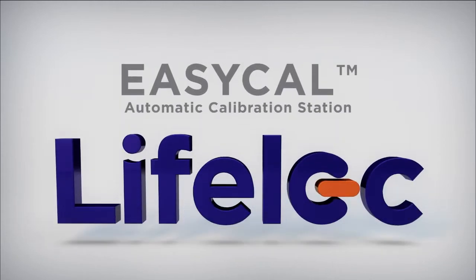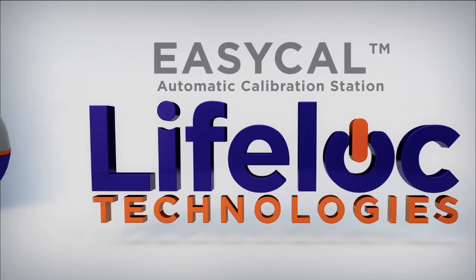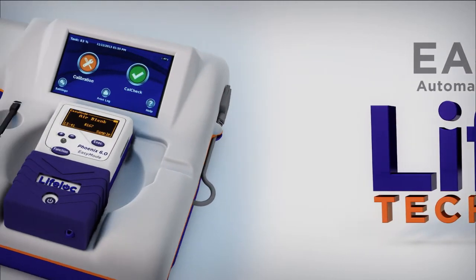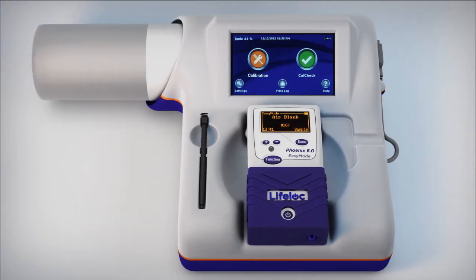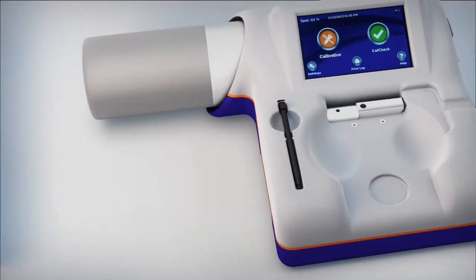The EASYCAL calibration station from Lifeloc Technologies automates evidential and screening breath tester calibration and calibration checks, making them easier, faster, and error-free. For the first time in portable breath testing, you can initiate and complete an entire instrument calibration sequence with the touch of a button. Operator error, confusion, and uncertainty are gone forever. Watch how easy Lifeloc instrument calibration can be.